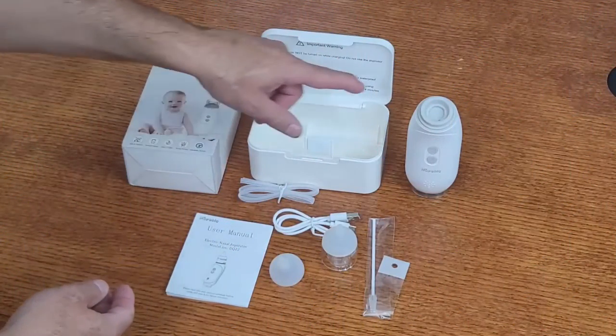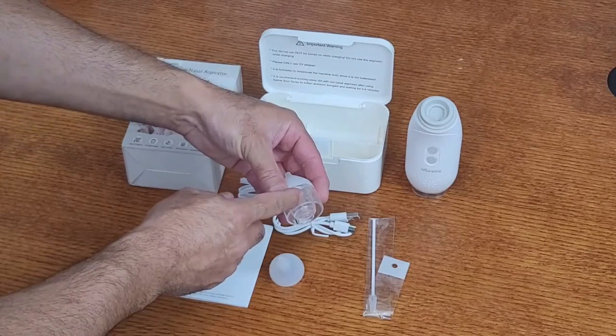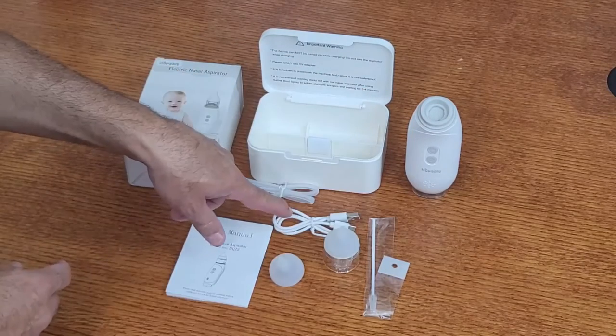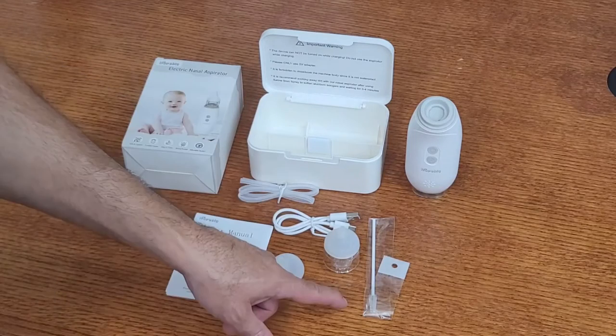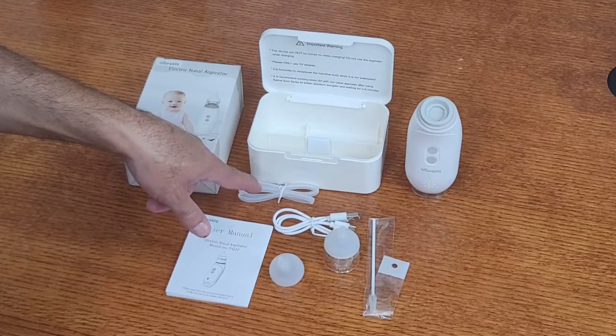It comes with a storage box, aspirator device, two silicone suction covers, snot storage tank, a USB-C charging cable, a little cleaning brush, and a small tubing set to complete the final cleaning and rinse.